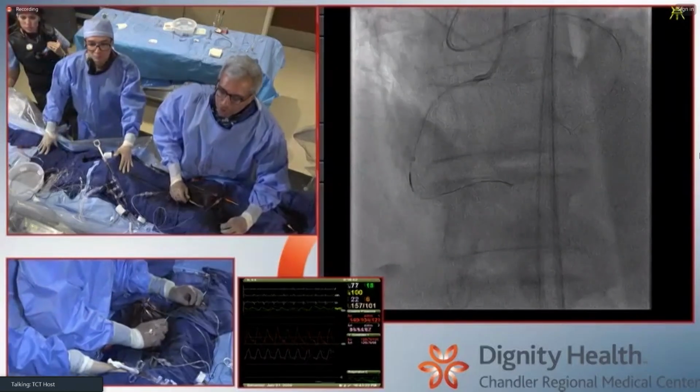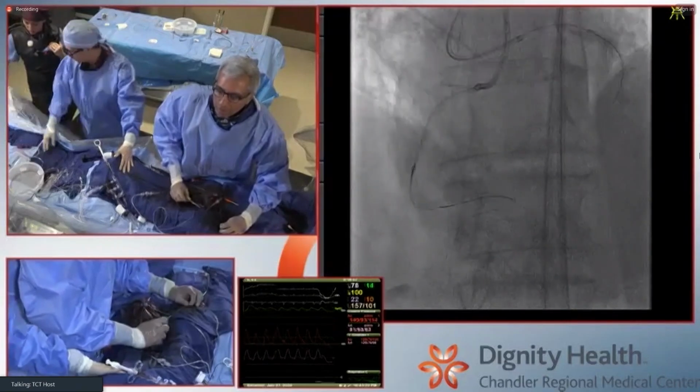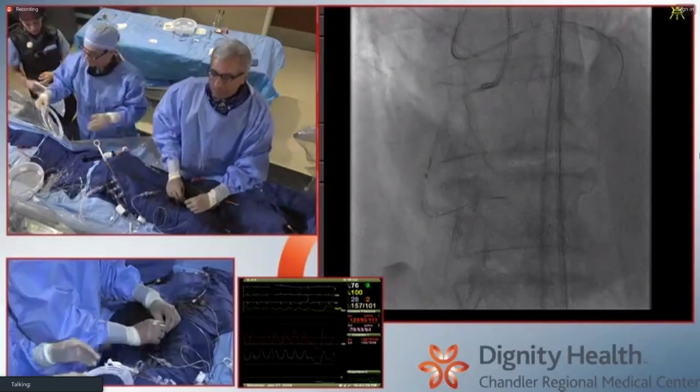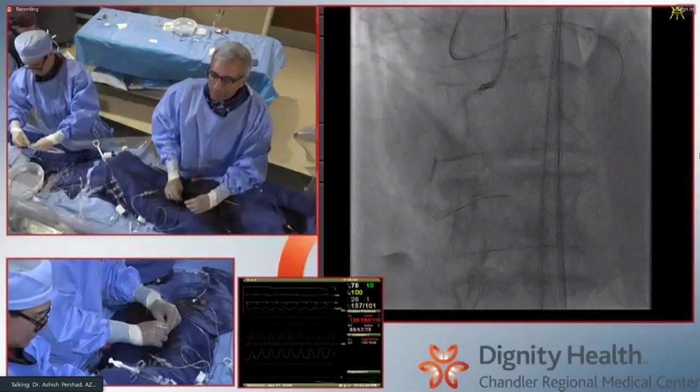Do you have an RG3 externalization wire preference? Are you an R350 guy? Are you an RG3? Do you have a particular reason why to use which one when? Yeah, usually give me my RG3, that 330 is the one which we use normally. It's the one which is commonly available. That's the main reason.